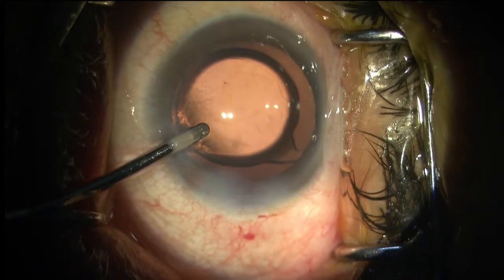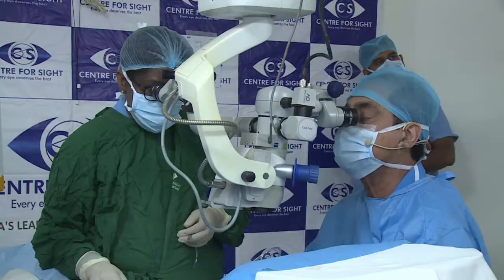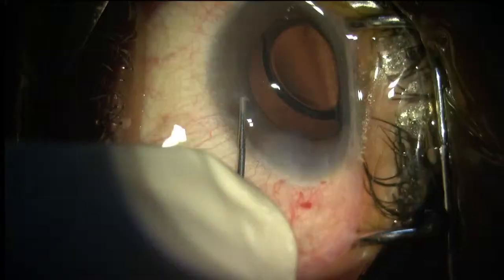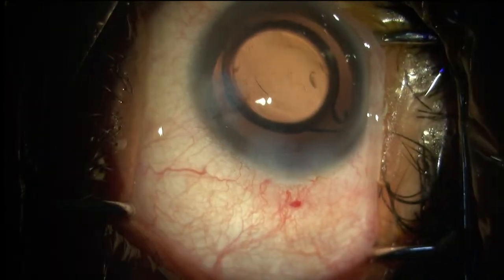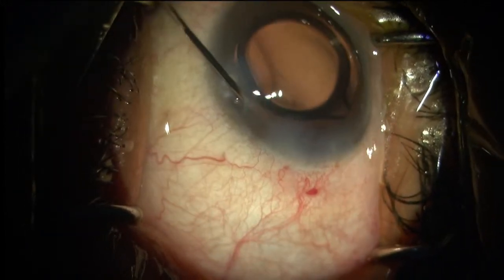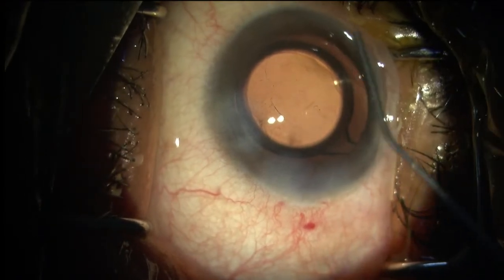So the first eye when you do, then you talk to the patient whether he wants better vision for near and distance. Switch off the continuous. If the patient wants better vision for near, accordingly we'll plan what he has got in the other eye. So the second eye always depends upon what the patient wants. If suppose the patient has got 6/6 vision for distance and feels that he'll be happy having a little bit of near vision, then you plan minus 0.75 or something in the other eye, which will give him excellent computer vision.